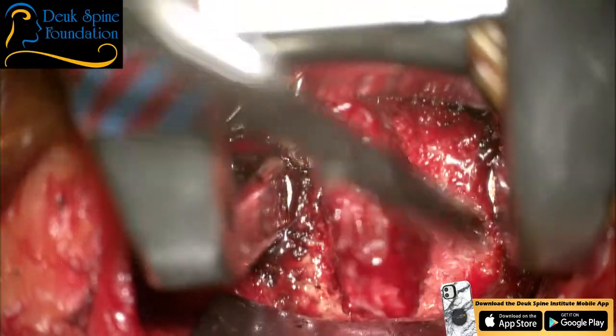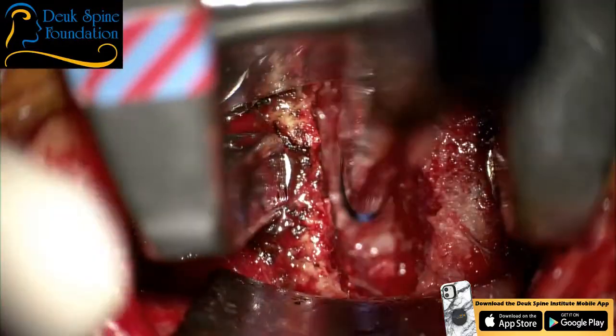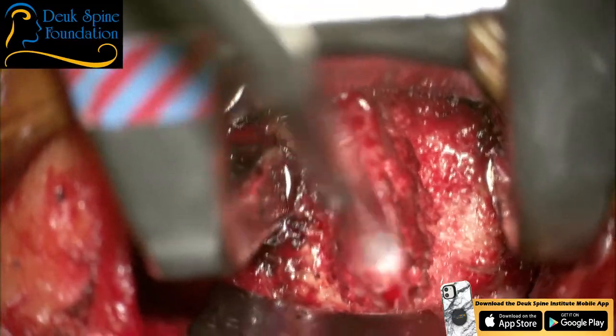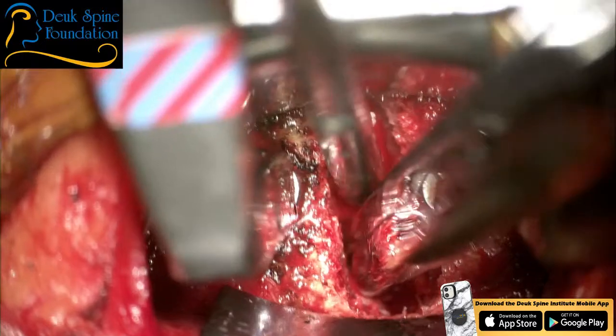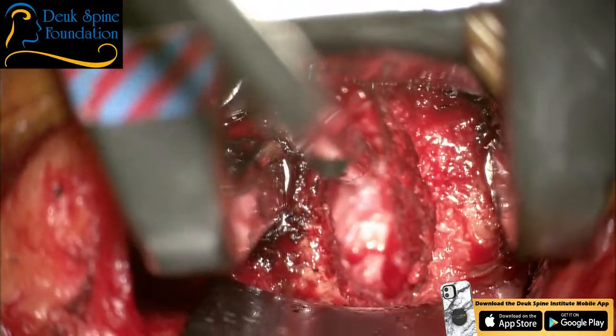Suck, suck. Did you have another question, Sean? No others currently. That's the nerve, by the way. That's the C7 nerve root right there. It just took a nice bite of bone and disc material and thickened ligament. Decompressed the foramen.